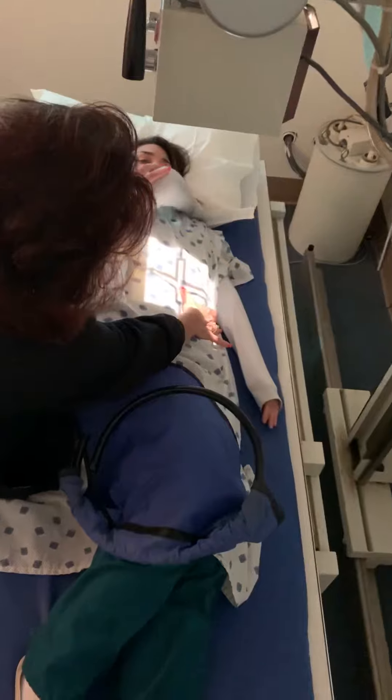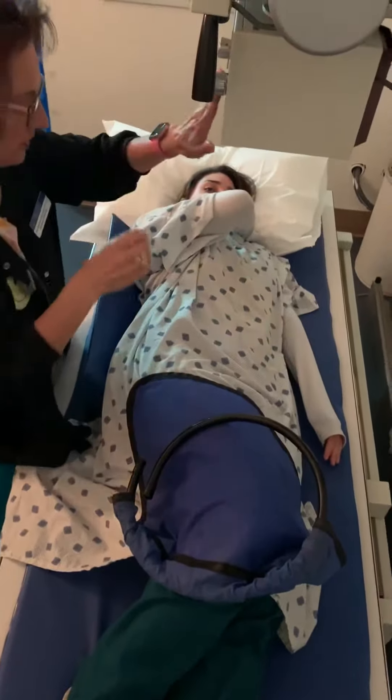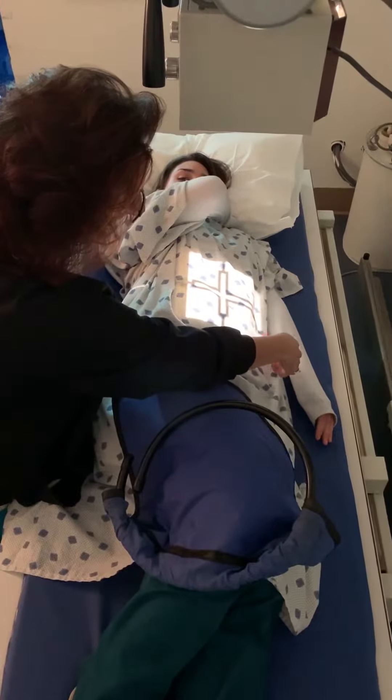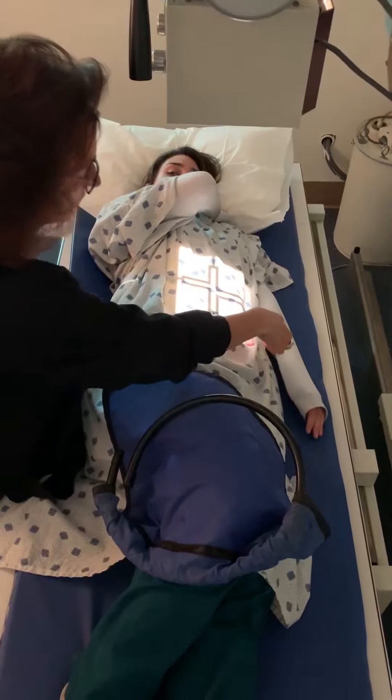Just got to watch her elbows in there. Good, just like that. And then I still need the left marker on the left side, trying to get that to stand out a little bit.